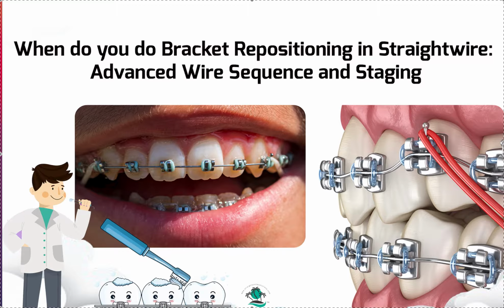Now remember, not all IDB is the same, and I've had the pleasure, in some ways, of touring a lot of labs that use IDB, and I've seen good stuff and I've seen bad stuff. If they're not willing to show you the STL, or at least a series of photos of how the brackets are positioned before you approve that case, it is not digitized IDB, and that is the number one question. So when I work with doctors with StraightSmile Solutions, I always recommend certain companies that allow us to confirm the bracket position first, because I've seen some terrible work that's done with IDB, and they're selling you an arm and a leg, but you're looking at it, it's not right. So what's the point of doing IDB if it's not going to be perfect, right?